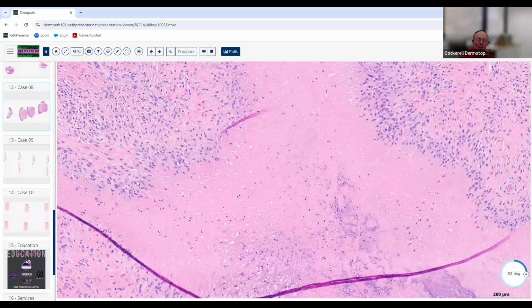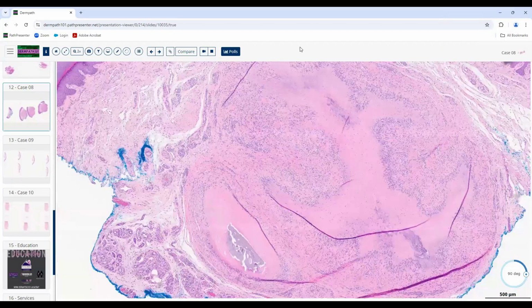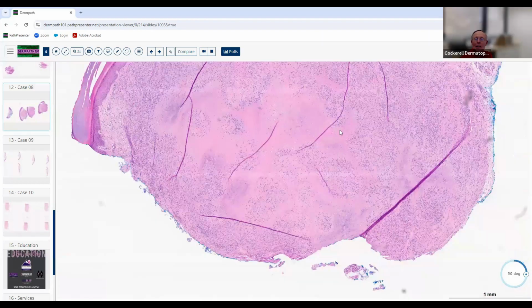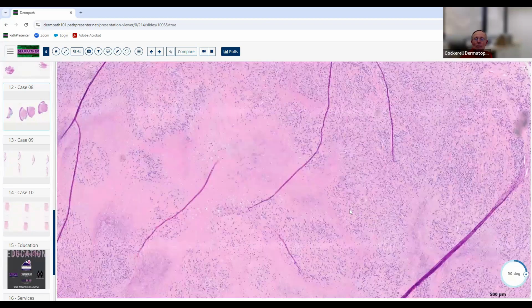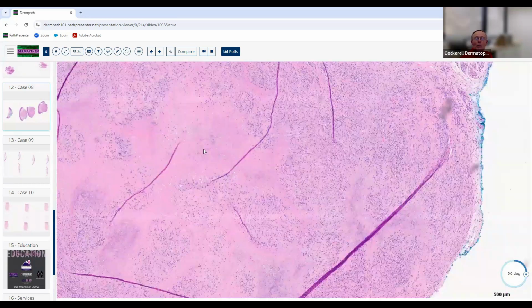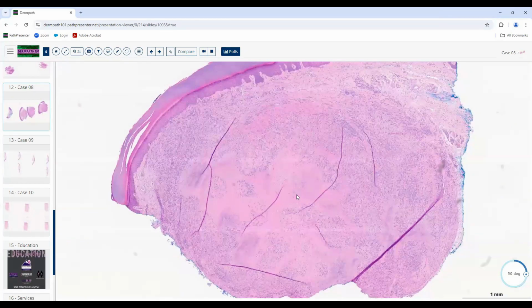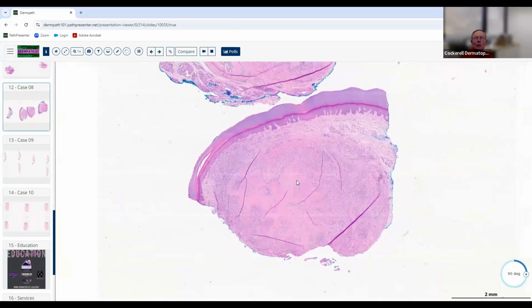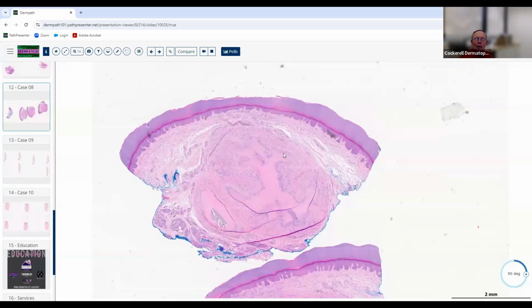So here are the histiocytes. Mucin, mostly fibrin in the center of the palisade. Yes. So what disease gives you fibrin in the center of the palisaded granulomatous dermatitis? I'm not sure what that splinter is doing there. Maybe a rheumatoid nodule. Maybe the person had rheumatoid arthritis, had a rheumatoid nodule and got an injury and got a splinter in there.